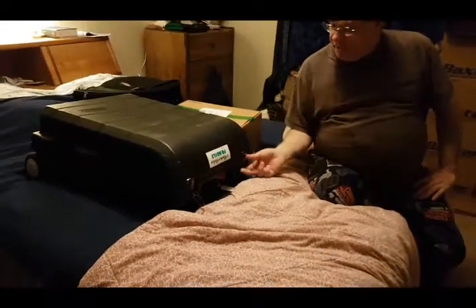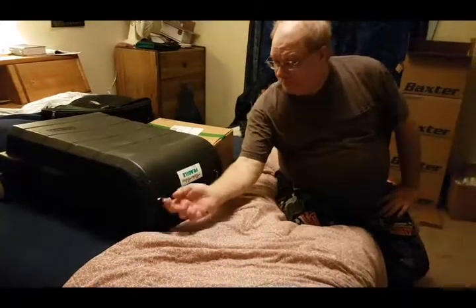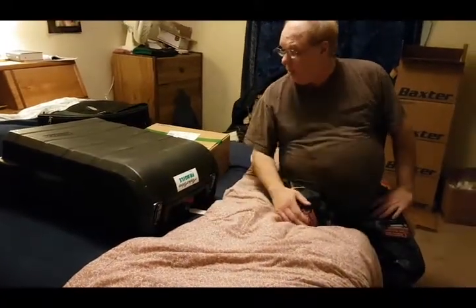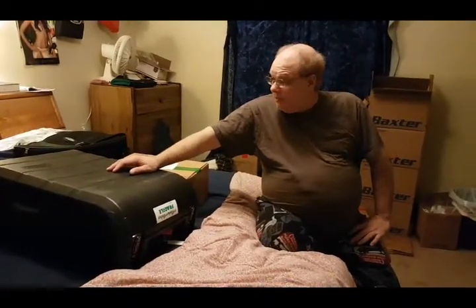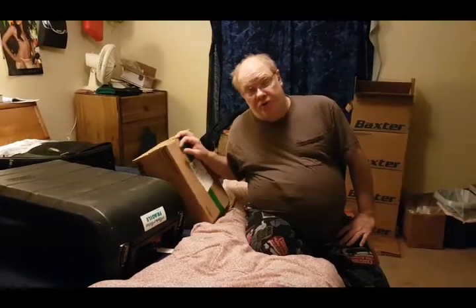And as you can see, it's got an Alaska Airlines Fragile tag all over it. And so the machine goes in here. Total weight is about 49 pounds. A box of solution goes with me for an overnight visit. Total weight of 12 liters of sugar water, which is approximately 47 pounds. And then I toss in a 2-liter bottle of water on top of that. That all goes in this case here.